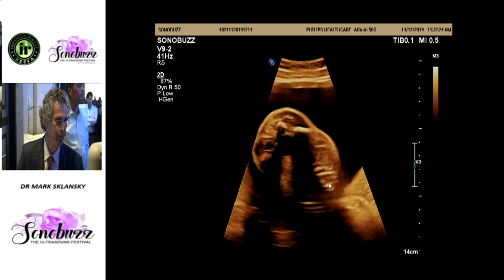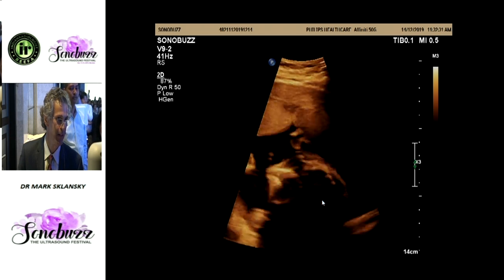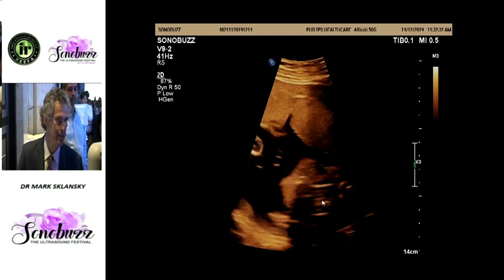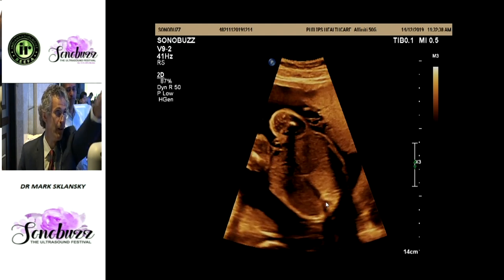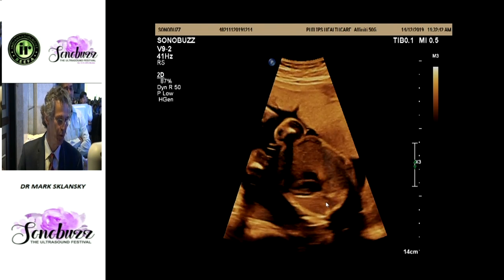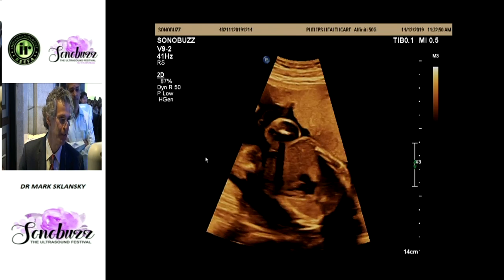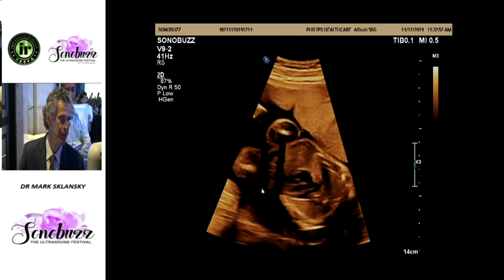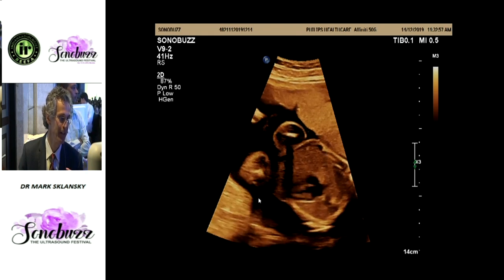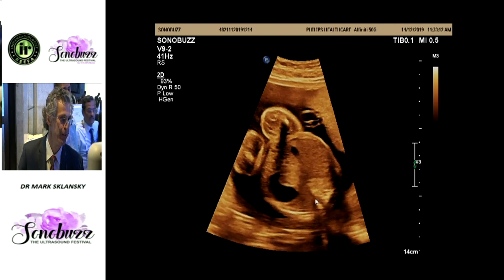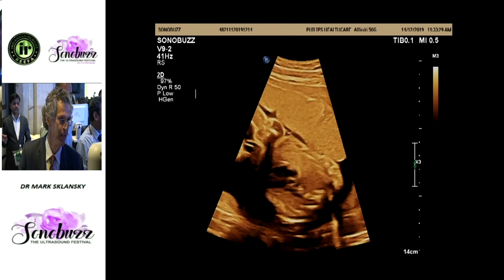First we need to find the spine — the spine is down here. The head is down here, so now we know the spine is here, the head is towards me, and the feet are towards the front of the room. The baby's head is down here on maternal right, so this is going to be fetal left. That's the way I like to figure it out — by thinking about how the baby is lying on the mother. So here's spine posterior, and now we know this is fetal left.